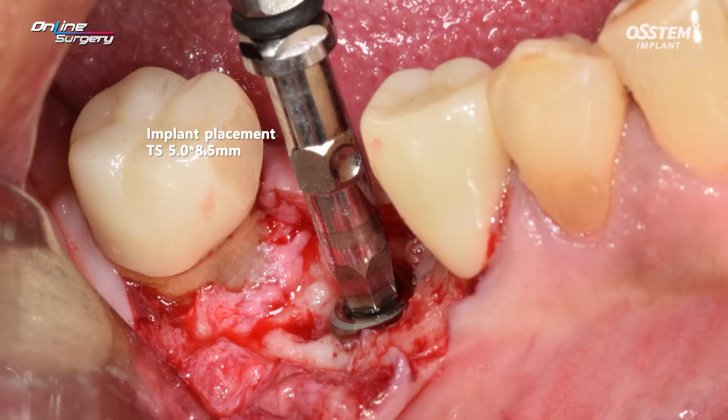Sometimes the mesiodistal proximal side bone level would be different, but in this patient, the buccal and lingual bone levels are different. Lingually, the implant is at least 1 millimeter below the bone. However, on the buccal side, at least one thread is exposed.